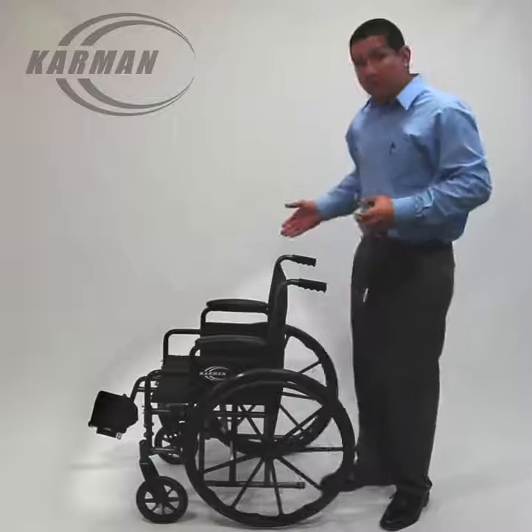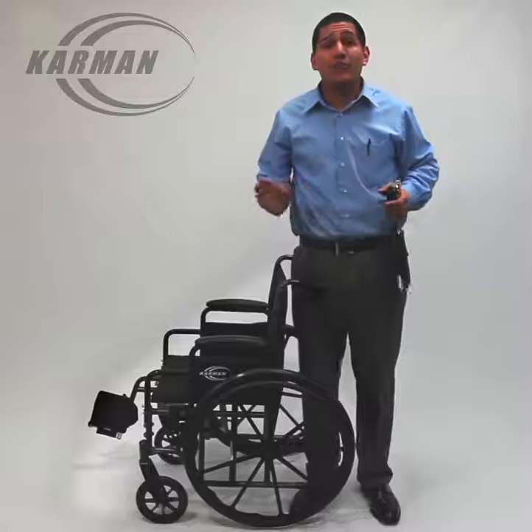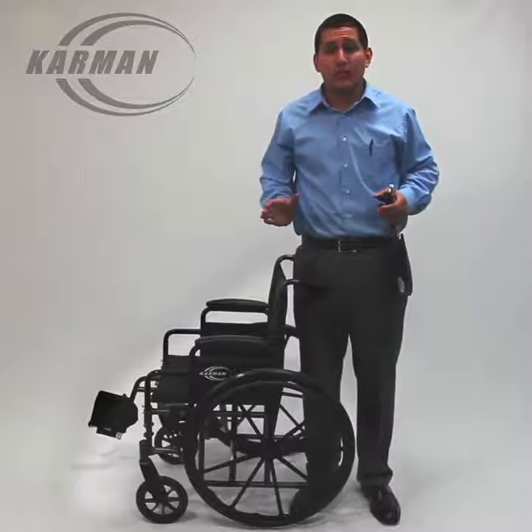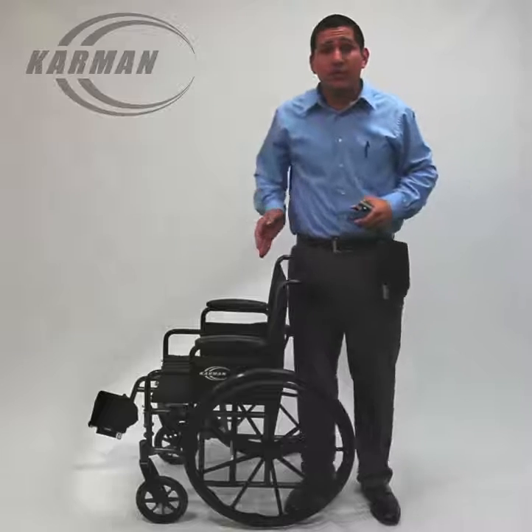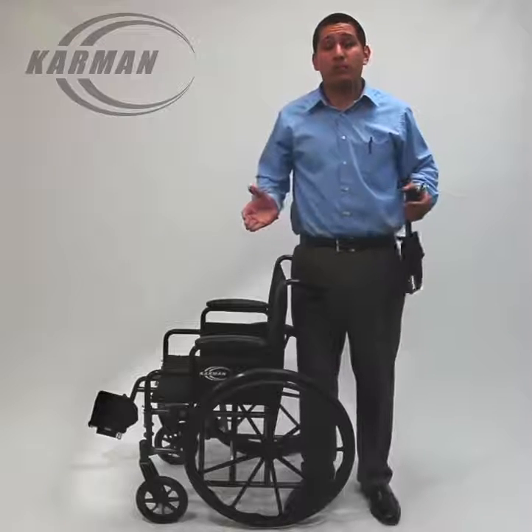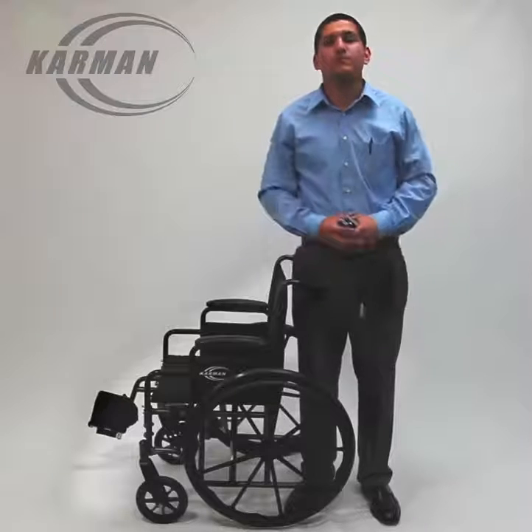This model, as I mentioned, is a standard lightweight. In Medicare terms, it would be a K3 standard lightweight wheelchair. Once again, this model is the LT 700T. For more products or specs, please visit our website at www.karmanhealthcare.com.